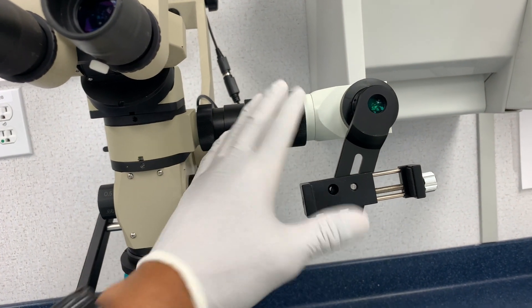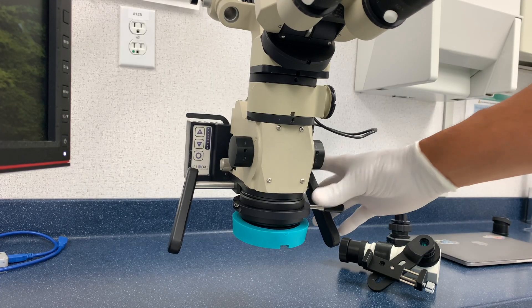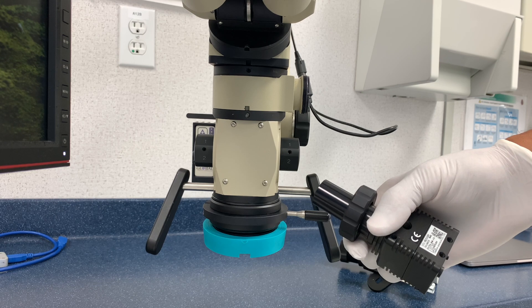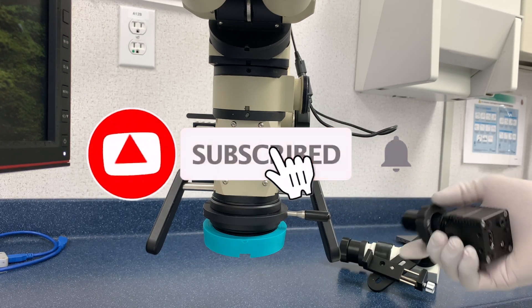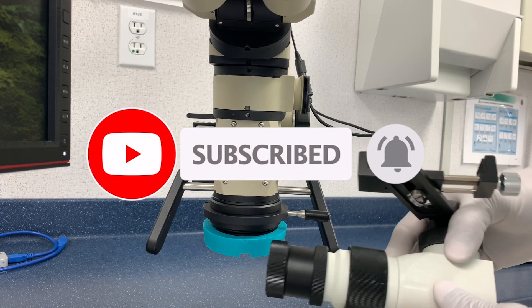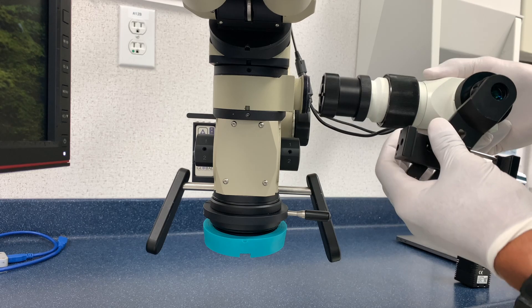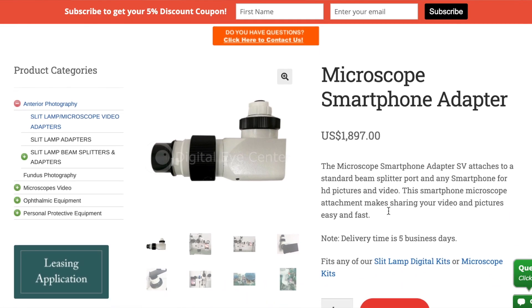I've got a new camera for my microscope. It's actually an adapter for my iPhone. Long story short, I had to get a new camera because I sold my old camera by accident when I sold a microscope. This is another makeup one that I have. But I saw this online and it was actually a decent price, so I'm like, you know what, let's give it a shot. And sure enough, Alberto at Digital Eye Center sent it out and I fell in love with it.